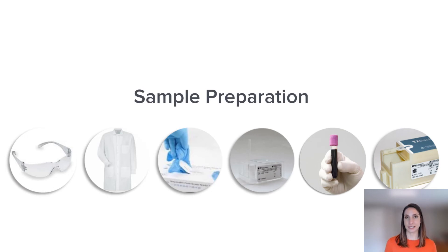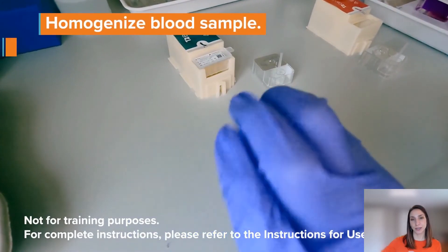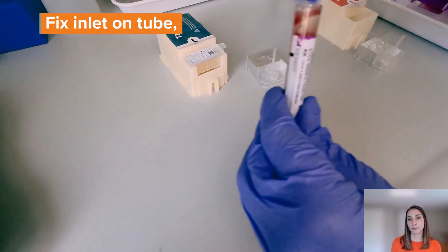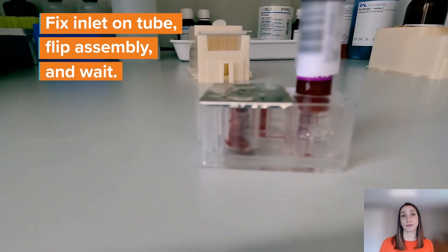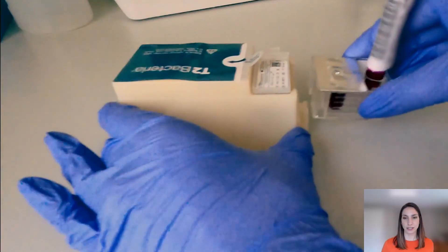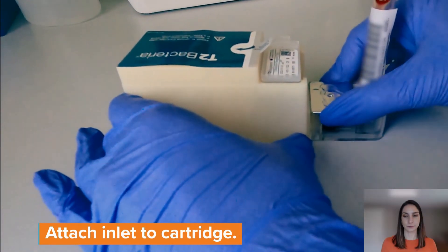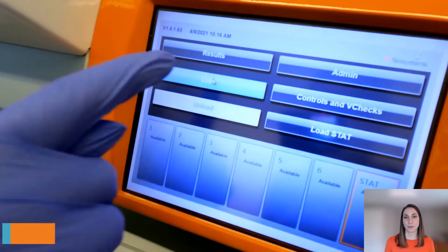Next, sample preparation — very simple. There is really no sample preparation other than homogenizing the sample. We need to make sure the blood sample is homogenized, as it may have been in storage or in transport. Invert the tube eight to ten times, then take off the cap, fix the inlet or straw snorkel on top of the tube, flip the assembly, and wait for the reservoirs to fill. Once the reservoirs have filled, attach the cartridge and sample inlet together. You've now fully assembled your reagent tray, cartridge kit, and sample together, and we're ready to load the panel on board the instrument.